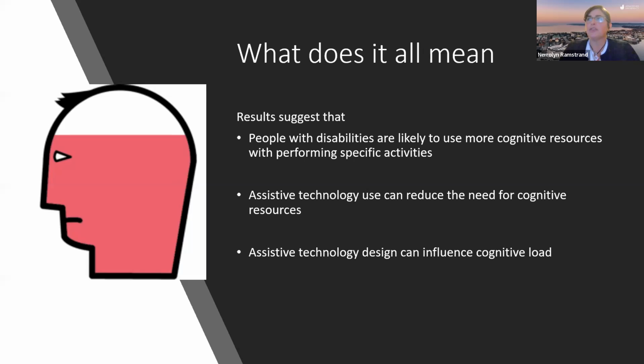And we also know that the design of devices has the potential to influence cognitive load. And I think there is a whole ocean of research we could do here with different designs of prosthetic and orthotic devices to try and look at, well, can we optimize them in some way using this technology? I'm not suggesting that it's the only way we should optimize, absolutely not, but it's one option that we have.